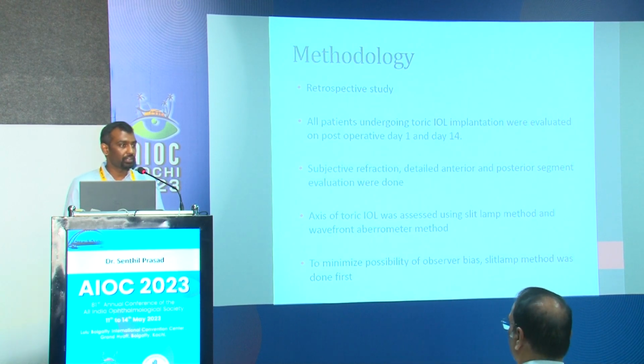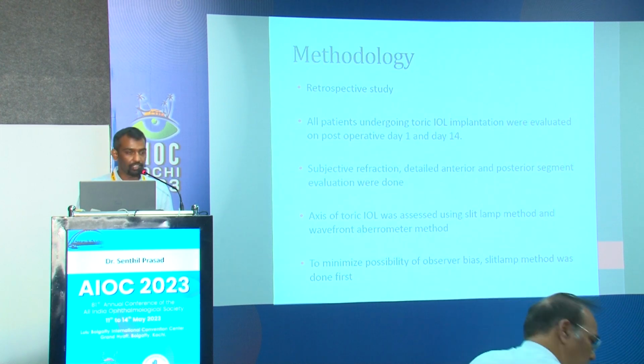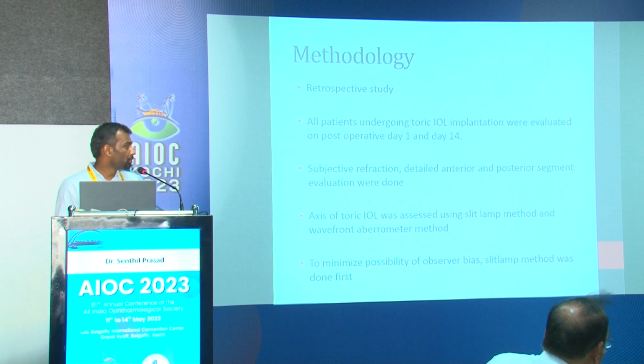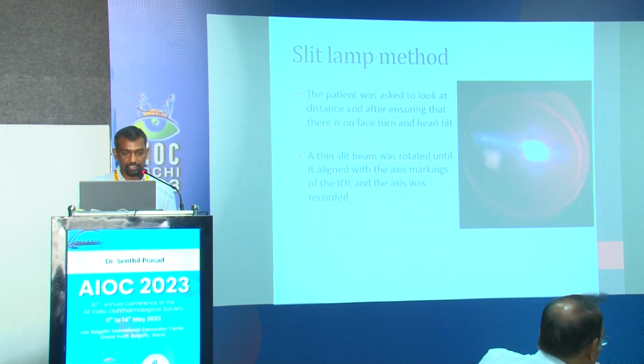All patients who were implanted with toric IOL were assessed on postoperative day 1 and 14. Every patient was subjected to subjective refraction, detailed anterior and posterior segment evaluation. In all patients, the toric IOL was evaluated using the slit lamp method and the Wavefront aberrometer method. To minimize observer bias, the slit lamp method was always done first.